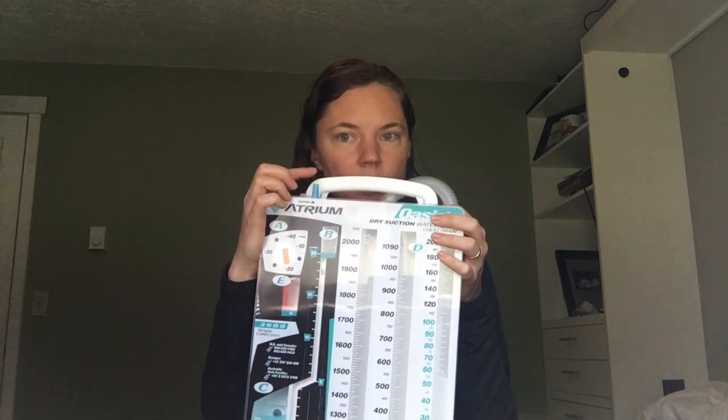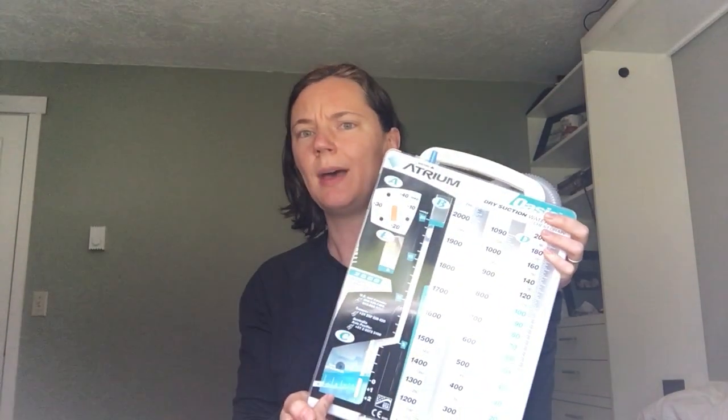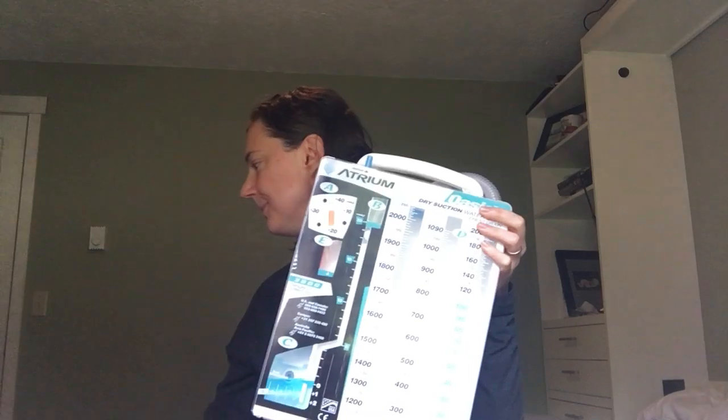Just checking really quickly on my notes to make sure I told you everything. If your patient was on suction and you've taken the suction off to check the air leak, make sure you put that back on after you check, because your patient needs to be on suction if they have it ordered to help their lungs heal and come back into place.